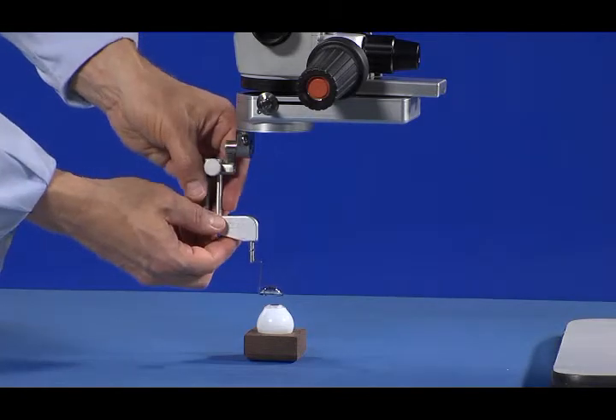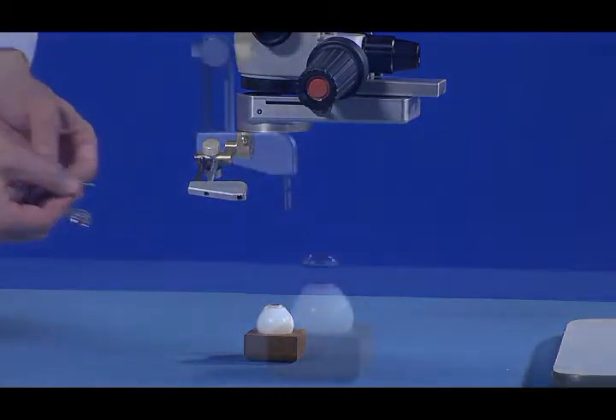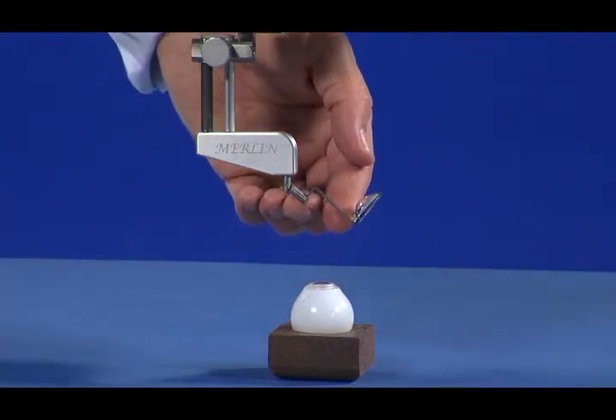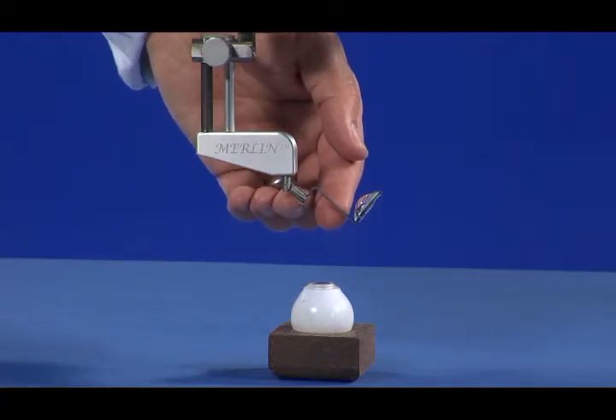Remove the lens by gently pulling the lens from the LPU. The Merlin surgical lenses have a safety hinge that allows the lens to move upward freely if it contacts an object beneath it.